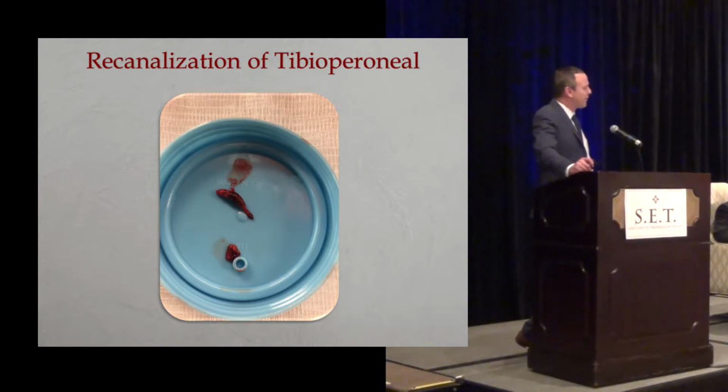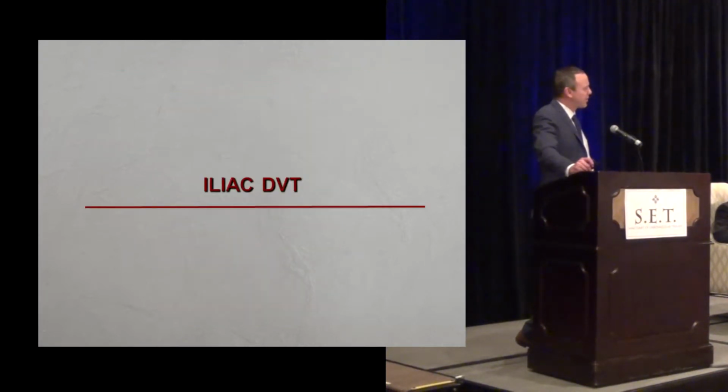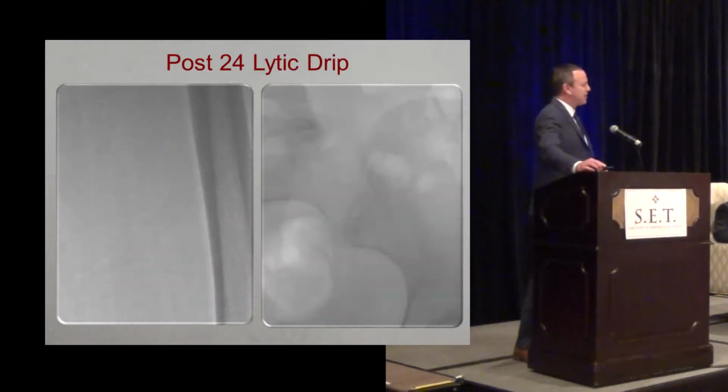Moving on to the venous side, this is a patient who presented with iliofemoral DVT, quite extensive DVT. This patient was actually lysed for 24 hours. You can see here post-lysis, probably the reason the clot didn't clean up that much is there's an outflow obstruction, as you can see there, through the iliofemoral segment.